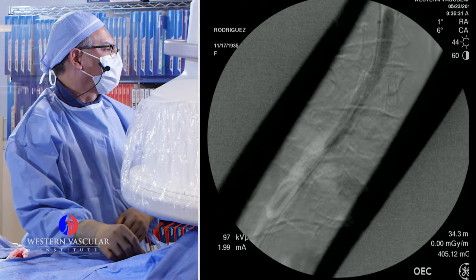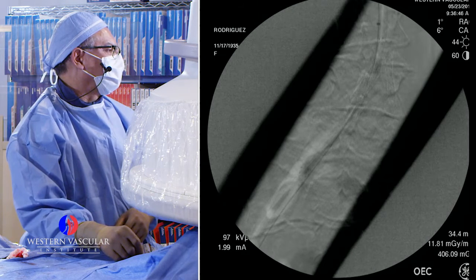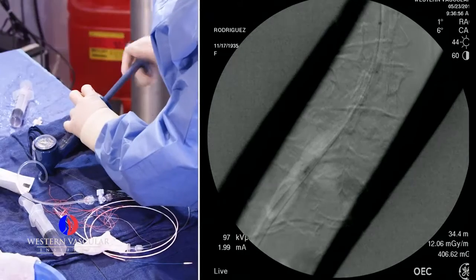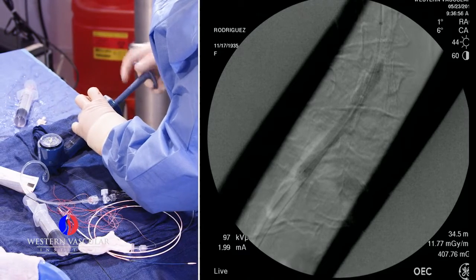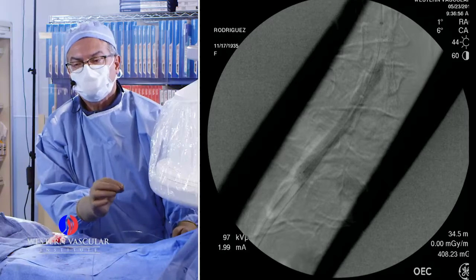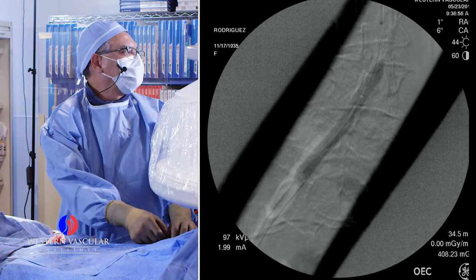Down. And then we're going to get the other end right here. Let's get to 12 atmospheres too. We already witnessed that the previous stent was collapsed. Although this one is a different one, it's still a type of stent that needs some force to make it go to the nominal size. The nominal size is the intended size or dimension that it should have. So I'm using this balloon to reach that.